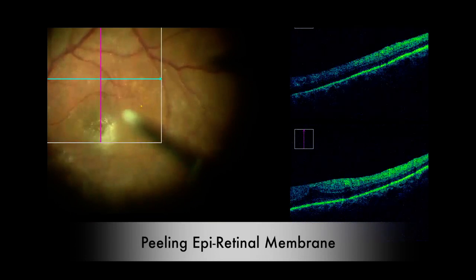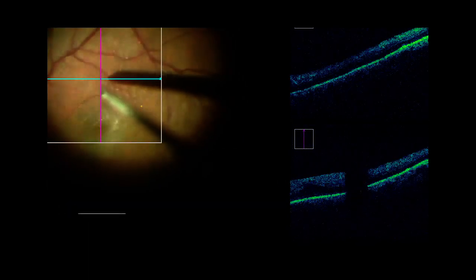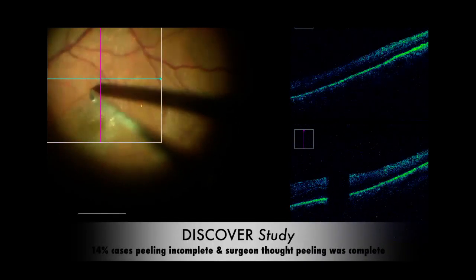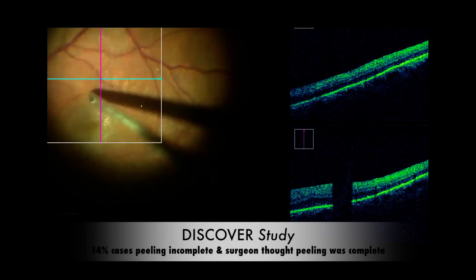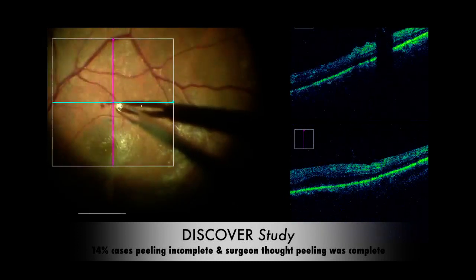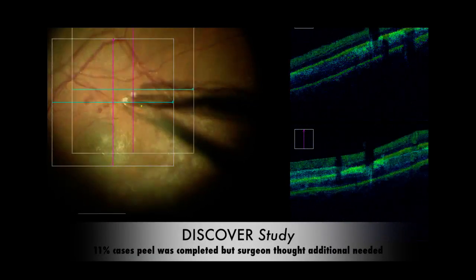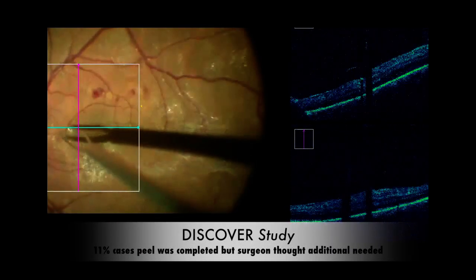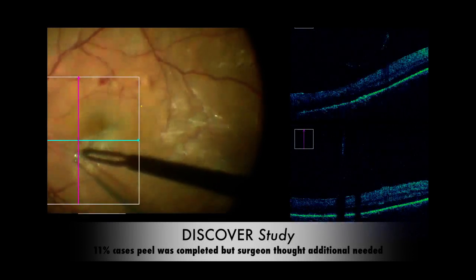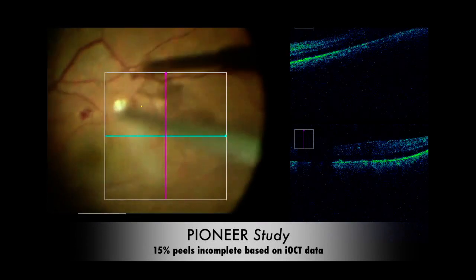The most common use of intraoperative OCT has been found in the treatment of macular holes and the management of epiretinal membranes. The DISCOVER study comprised surgeons with all levels of experience, yet still found 14% of peels were incomplete based on iOCT data. The study further showed that in 11% of the cases, surgeons believed additional peeling was required, while iOCT data showed adequate peeling had been achieved. Similar results were also seen in the PIONEER study.